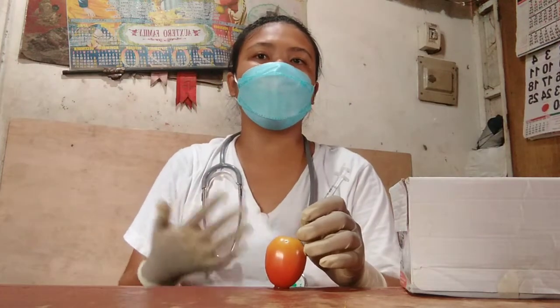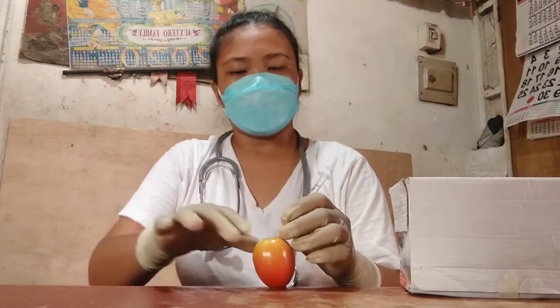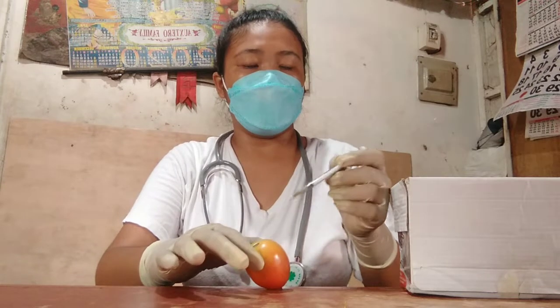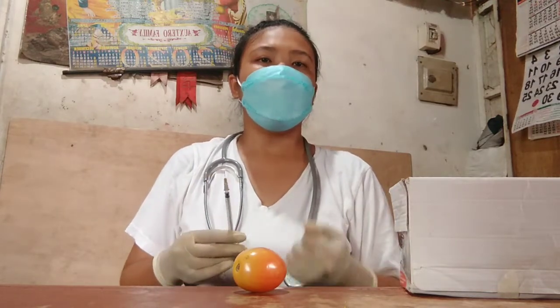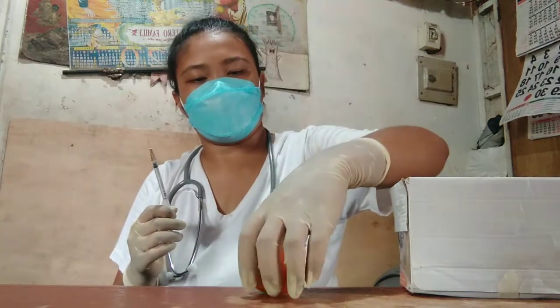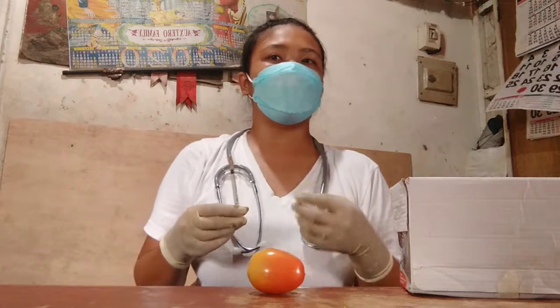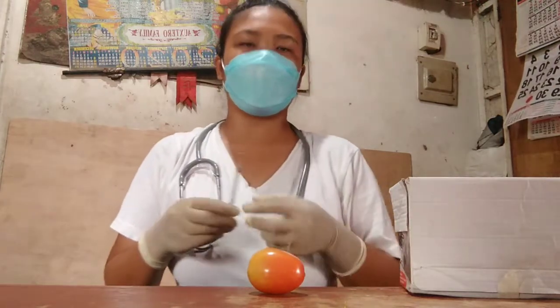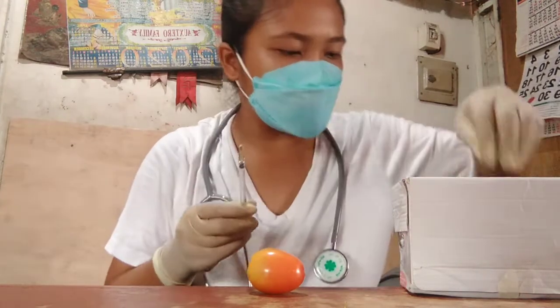Next, quickly withdraw the needle while applying pressure with a dry sponge. Quick withdrawal of the needle is less painful and reduces discomfort. Next, assist the client to a comfortable position to provide the client's comfort. Next, discard the uncapped needle and syringe in a safe receptacle. Proper disposal prevents possible injuries in the setting.